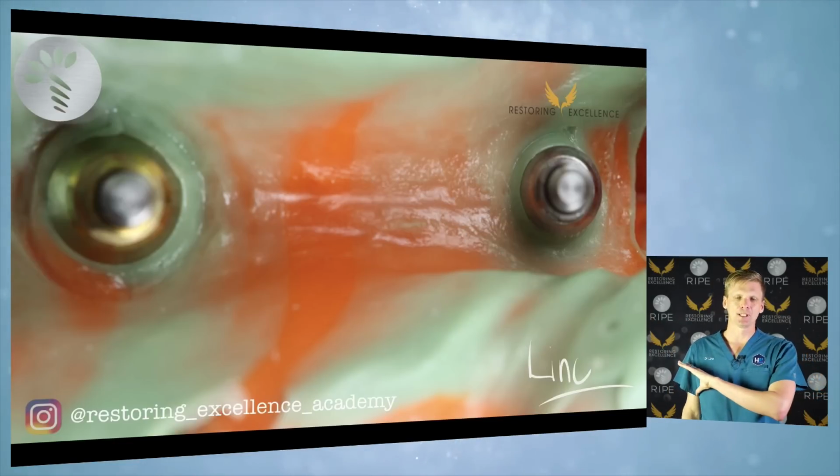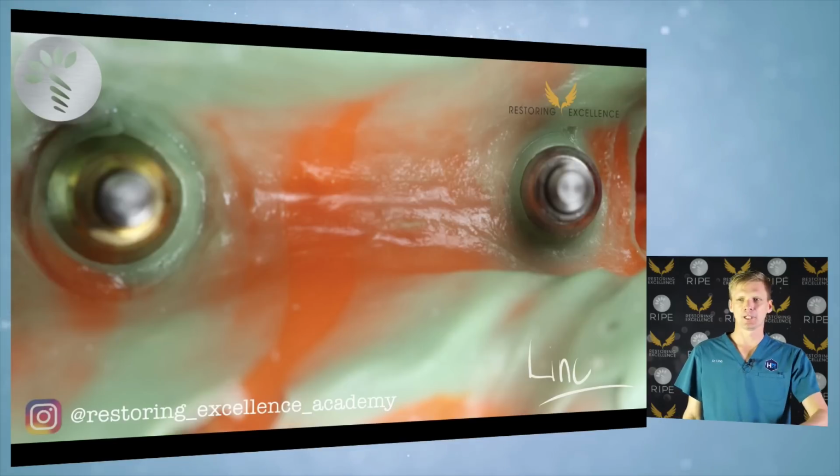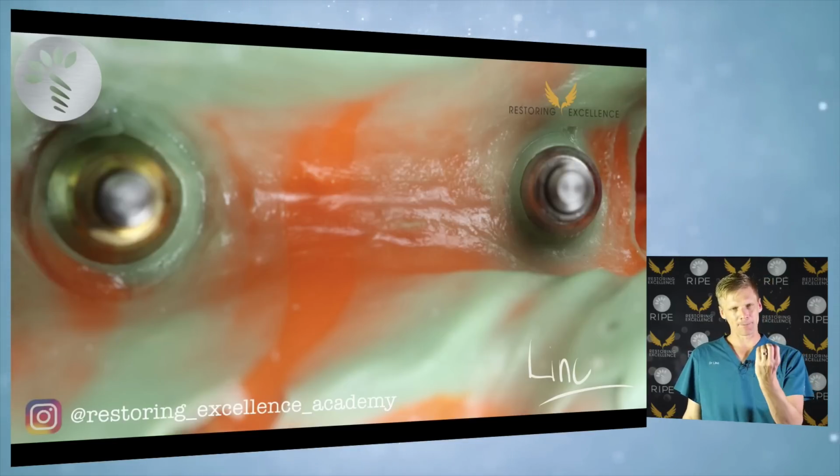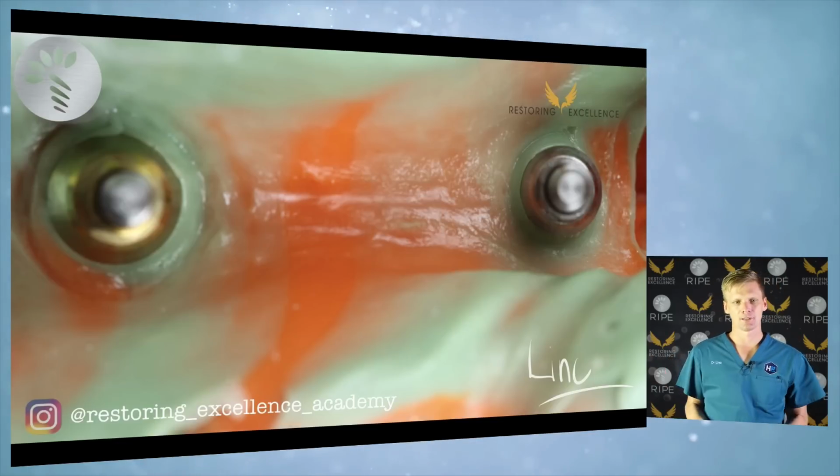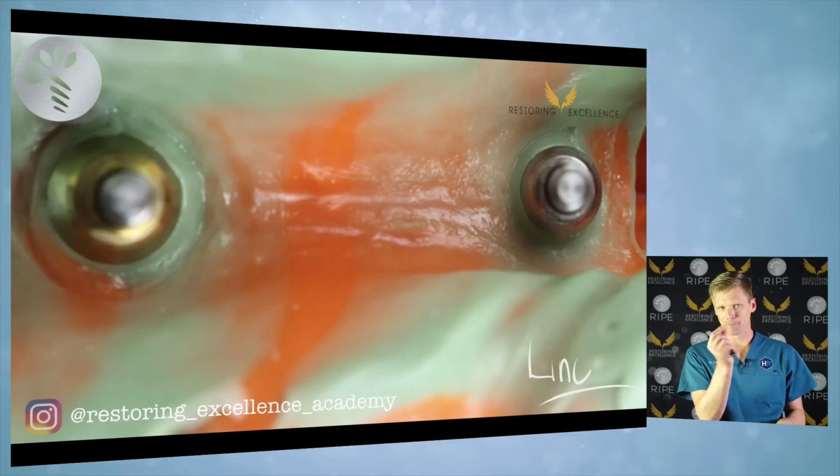So if you keep it all perfectly dry and inject light body everywhere, then you'll get this crisp capture of the abutments. But if you let moisture get everywhere, then you get drags. You get drag around it, and then your implant abutment wobbles.